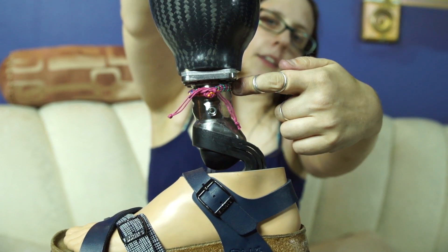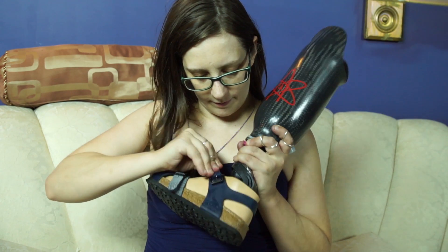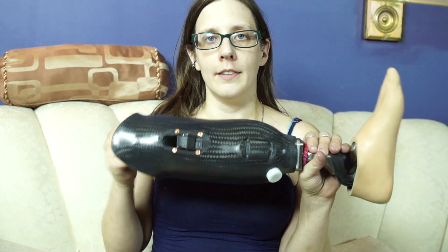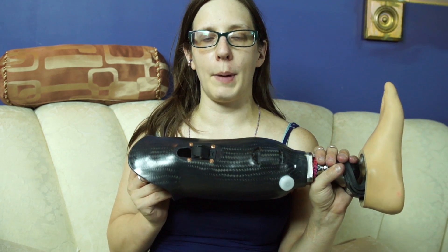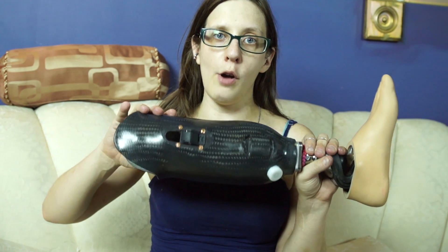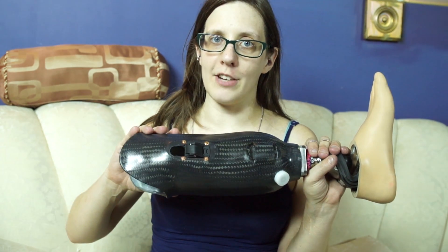This is my friendship anklet — very essential — and this is the foot. A carbon fiber socket is individually tailored for each individual, so this socket is made just for me and is custom-made for my residual limb. The way they make these sockets is by taking a mold of my leg, then making a positive, and laminating carbon fiber over it with vacuum lamination.